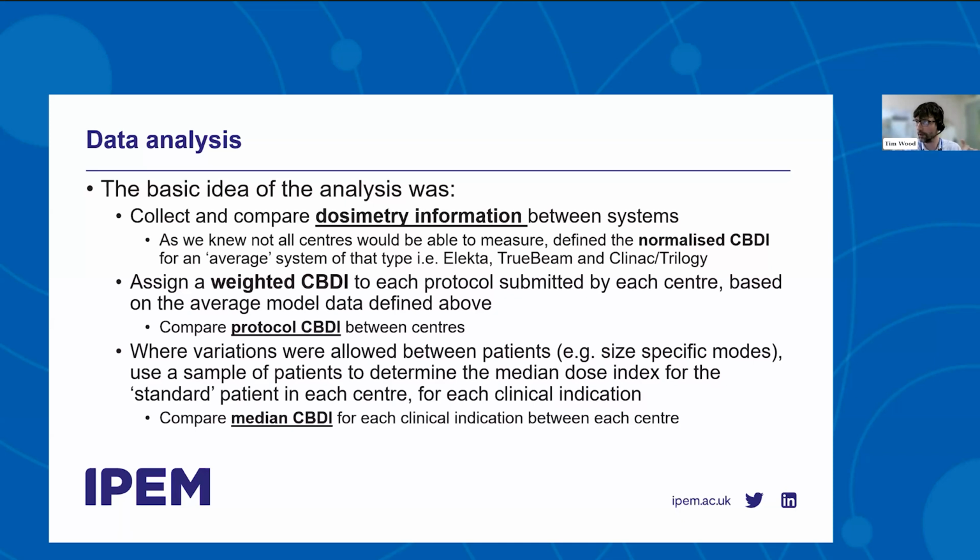All the steps above are us just covering over the cracks because we can't just go to a scanner, take a sample of patients off and just write down the associated dose values against indices. Okay? We've had to go this roundabout way of doing some measurements, assigning protocol doses and so on and so forth.